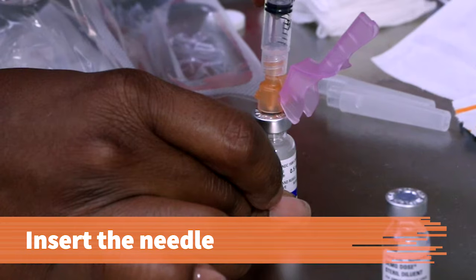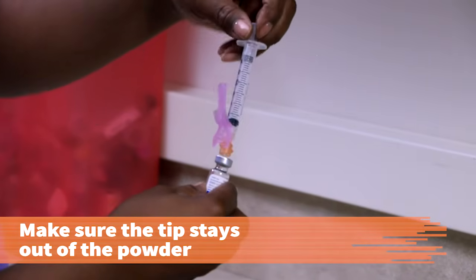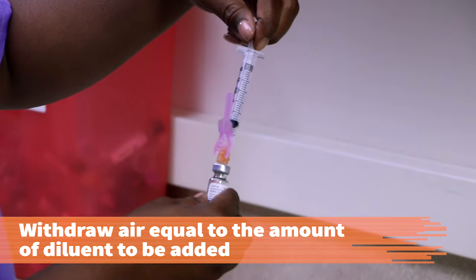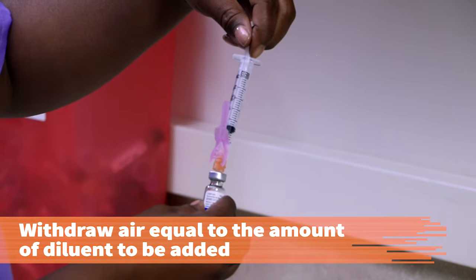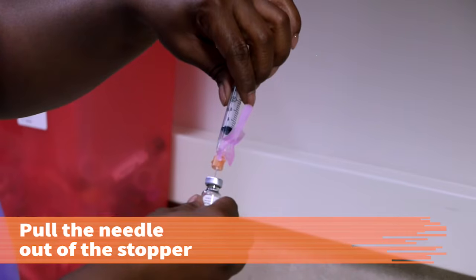Insert the needle of the largest volume syringe unit. Make sure the tip stays out of the powder. Pull back on the plunger and withdraw air equal to the amount of diluent that must be added. Then, pull the needle out of the stopper.